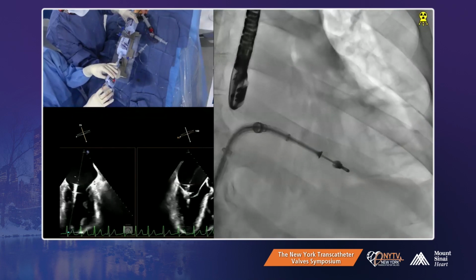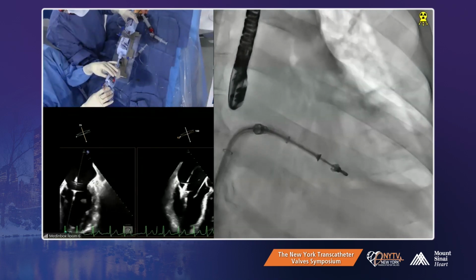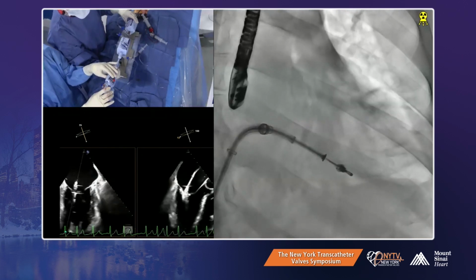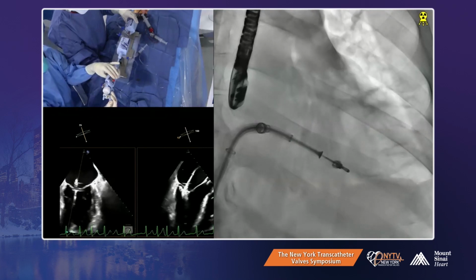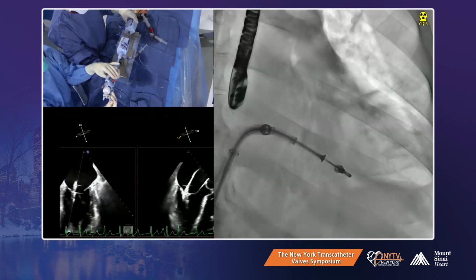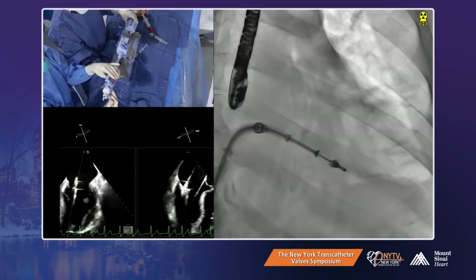Posterior is on. Hold it. You need to go more counterclockwise to get the anterior. Posterior is well inside, so go down and do counterclockwise. The posterior leaflet looks perfect. So go a little bit more down and then catch the anterior.